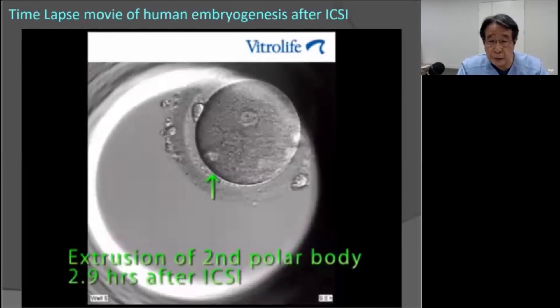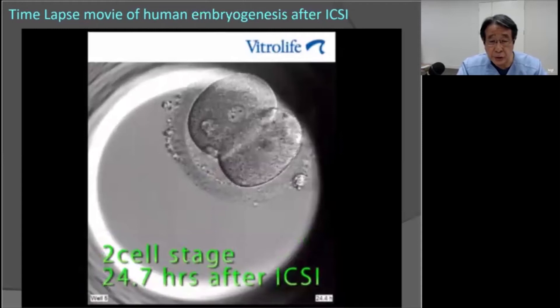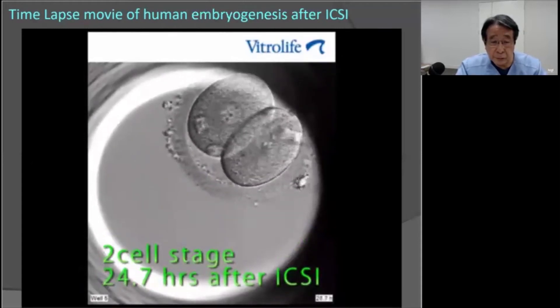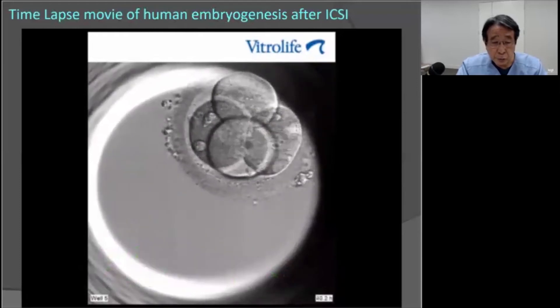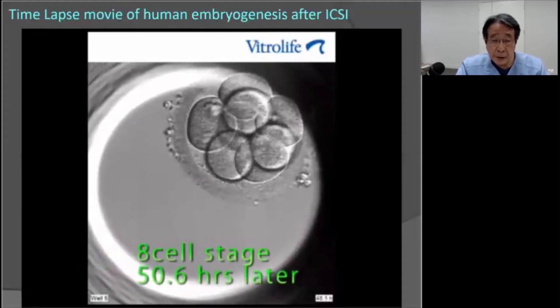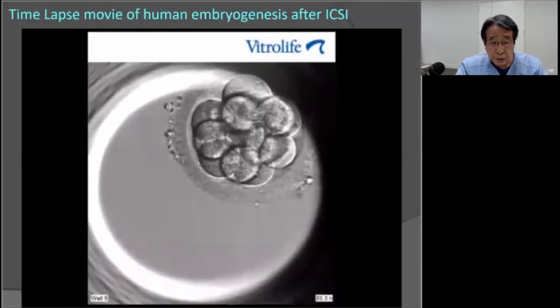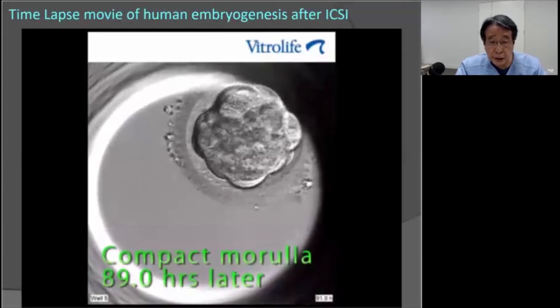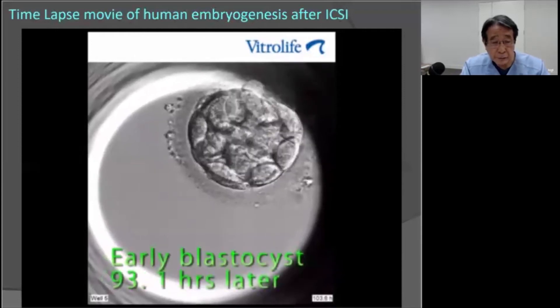This time-lapse movie shows human embryogenesis after ICSI: extrusion of the second polar body three hours after ICSI, disappearance of both pronuclei at 21 hours, two-cell stage at 25 hours, four-cell stage at about 40 hours, eight-cell stage at 50 hours, then 32 cells and a compact morula at 89 hours, proceeding to early blastocyst at 93 hours.